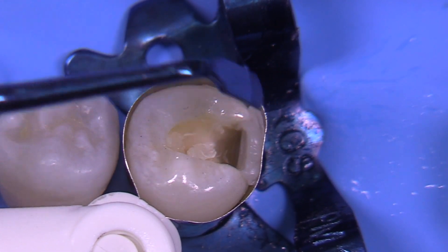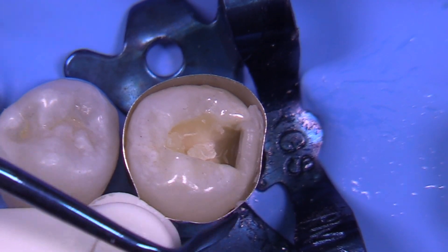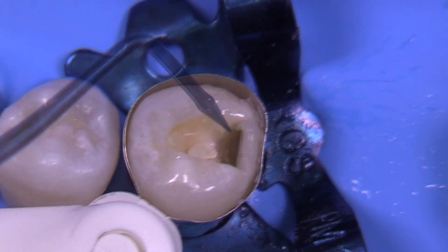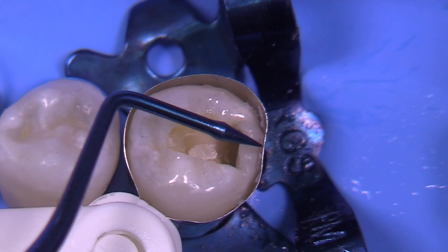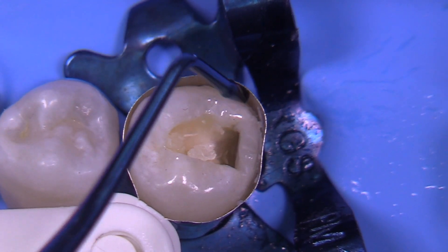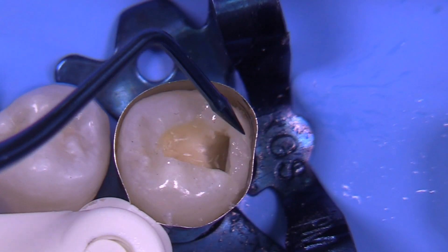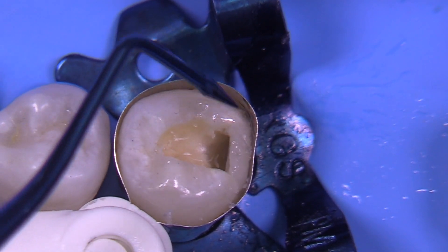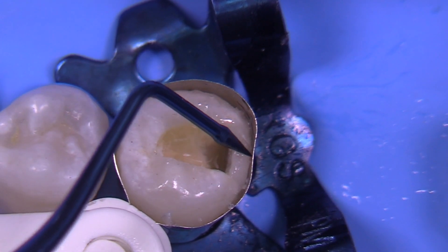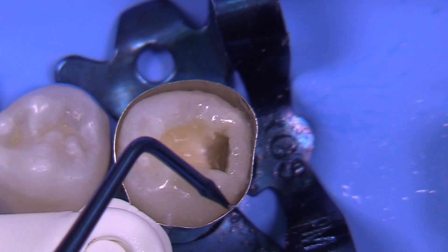We can push this little increment over with the PL2/PC2, and then I can use the PX12, which is a little bit wider and very thin — less than 250 microns — so it's great for getting into embrasure areas interproximally. These here are my prototypes: the GR12. I think they're going to be a welcomed addition to your armamentaria. I've tried to design them with efficiency and precision in mind. There's really nothing like this on the market today.